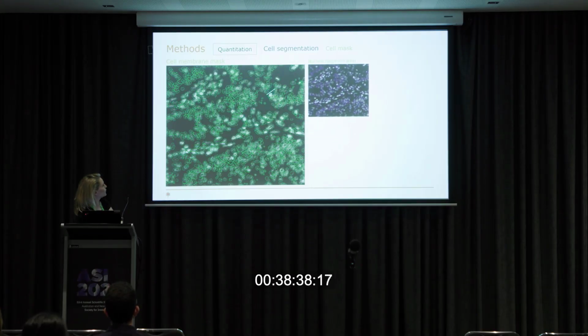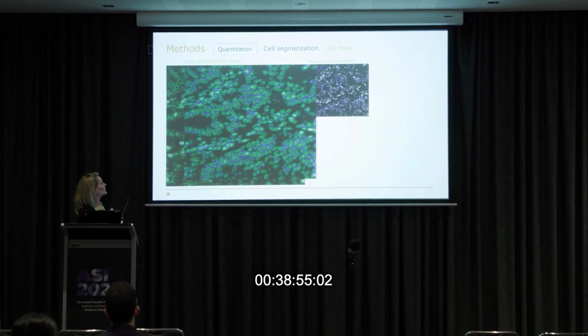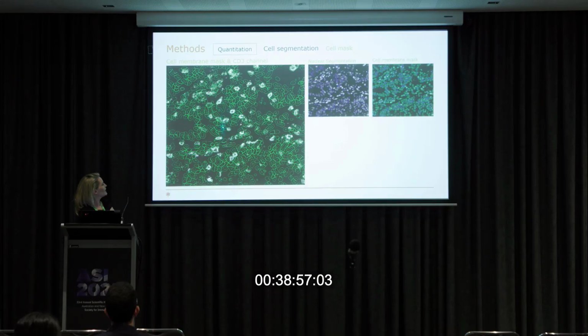So how do we look for the cell surface membrane? Well, we create a cell mask. This is still the DAPI channel, but here we've grown that nuclear mask outwards and inwards a little bit. And so we end up with a mask. This is now where we can look for our actual marker of interest. To know where to put this, because I have all the flexibility in deciding how much I grow it out and how much I grow it in, I will usually use a marker I'm looking at.